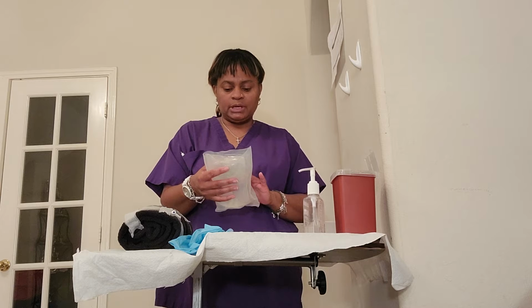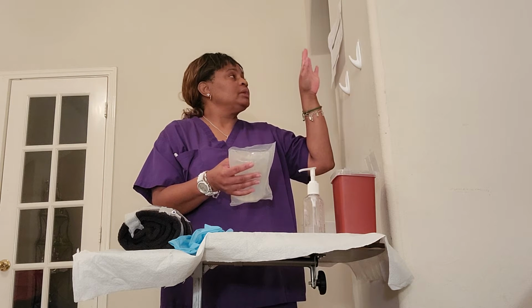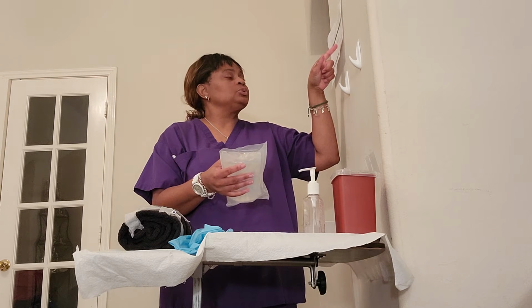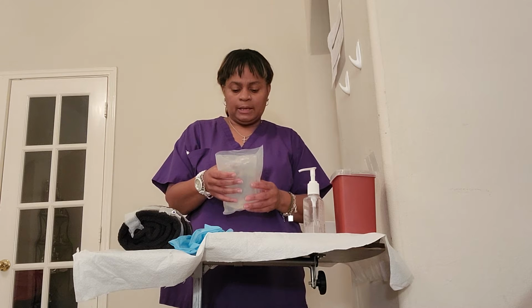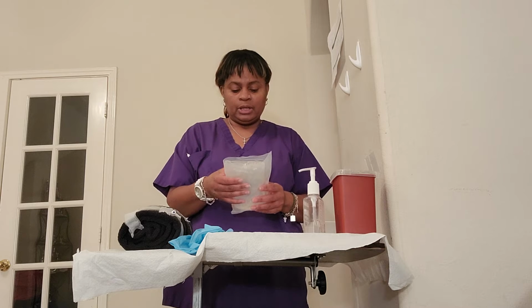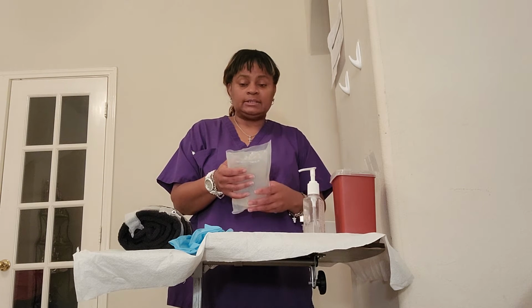I'm going to check the fluids one more time against the MAR. We are administering, this is for Millie Larson, and her date of birth is 1/1/1936. MRN 123456. No known allergies. We're administering 500 mLs of normal saline at 125 mLs per hour. The drop rate will be 21 drops per minute. I'm looking at 500 mLs of sodium chloride. This is what she'll be administered. Each 100 ml contains 900 milligrams of sodium chloride, and the expiration date is September 2022. That is my second check.